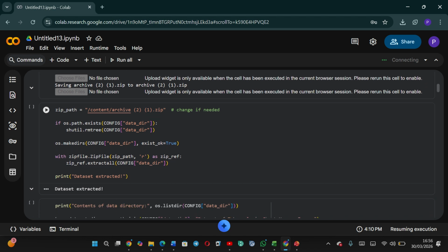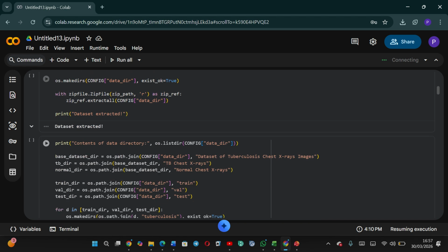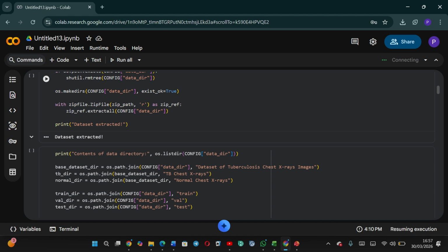Then we extracted the zip file containing the dataset. First, we check if the directory already exists and delete it. Then we create a new directory. Finally, we extract all the files we need for the training.